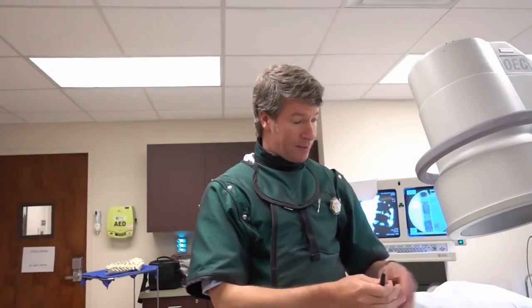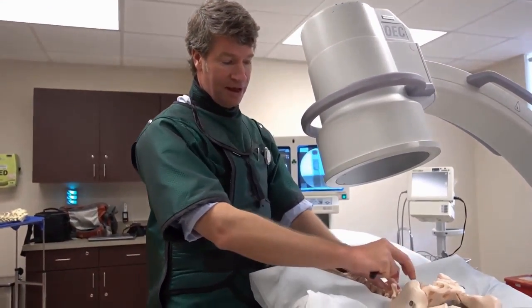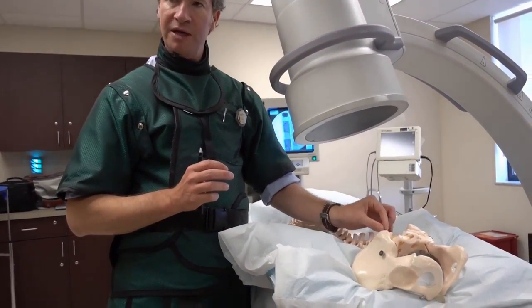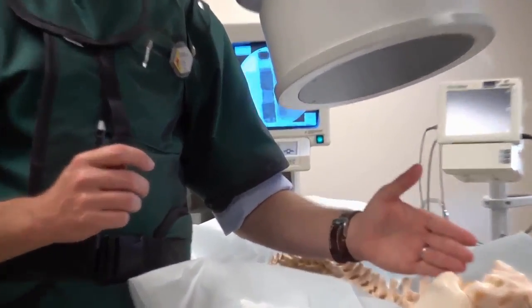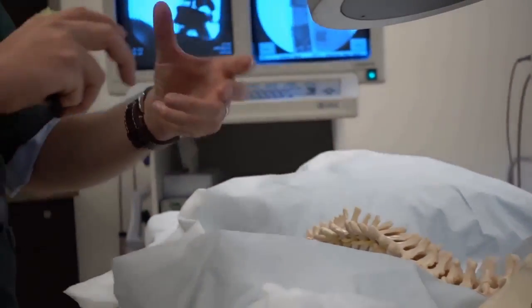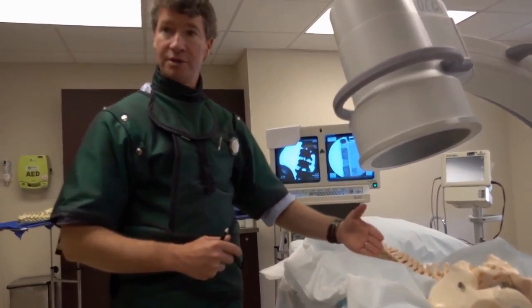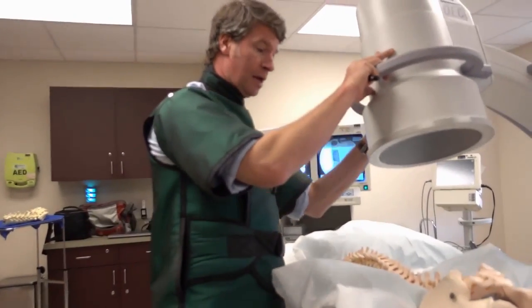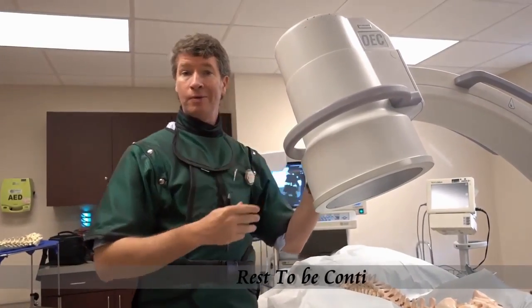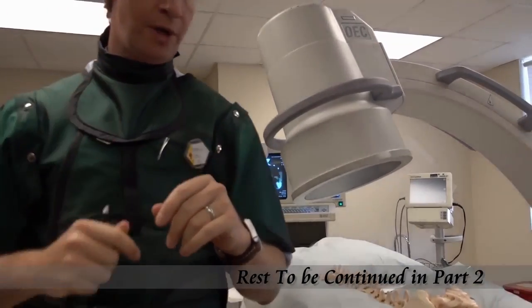Because sometimes what will happen is these vertebral bodies won't be all the same. They'll have a little rotation. One may be to the left and the other one's to the right. And so to know whether you're truly AP, you got to look at the spinous process of that particular vertebral body. And so, like in spinal cord stimulation, we may find that there's a lot of rotation, especially here in Florida. There's a lot of twisty ladies and men down here. We've got a lot of rotation in their spine. And as you're going on up, the fluoroscopist has got to be moving the C-arm and adjusting as they go, and always knowing where that nose is looking. If you look at the nose, you will know.